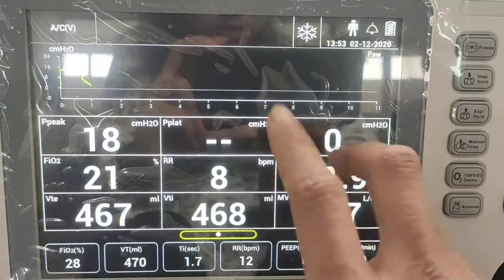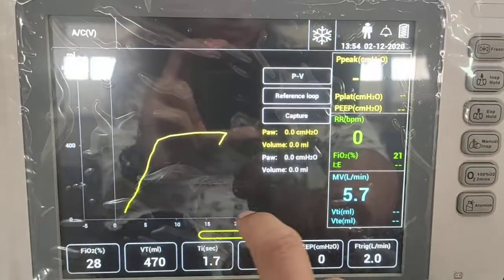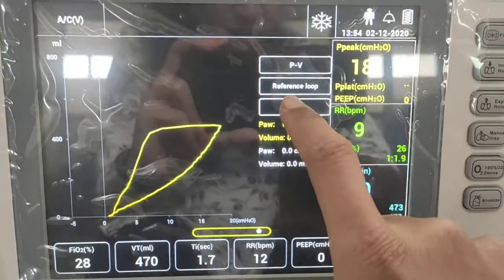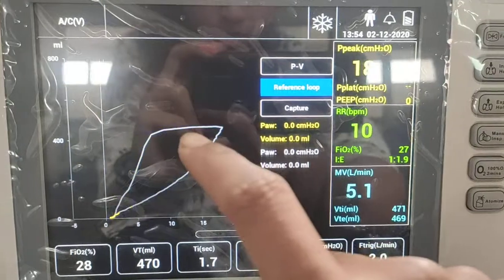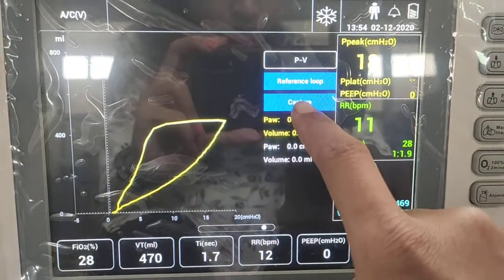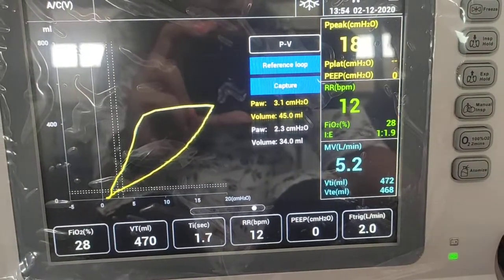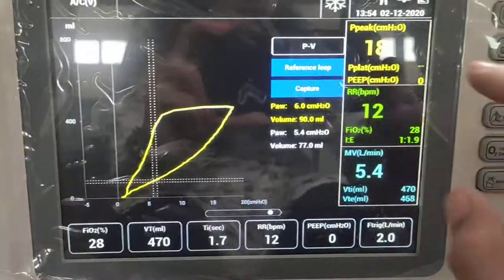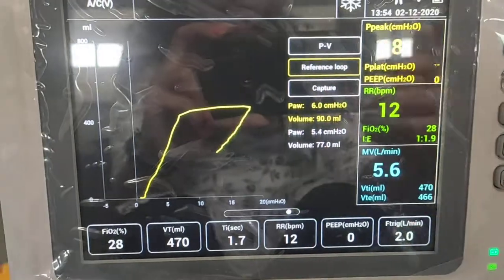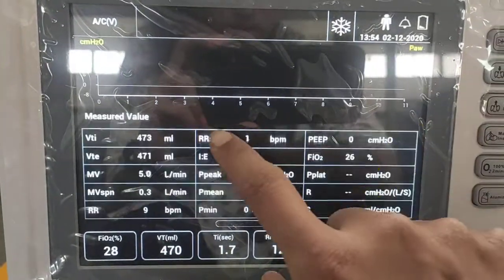The third screen shows big numerics. Another screen displays loops where you can select a reference loop for better examination. You can capture the loop for further study and view it later. To exit, press the reference loop button again and ventilation will continue. These are the types of screens available in the ventilator.